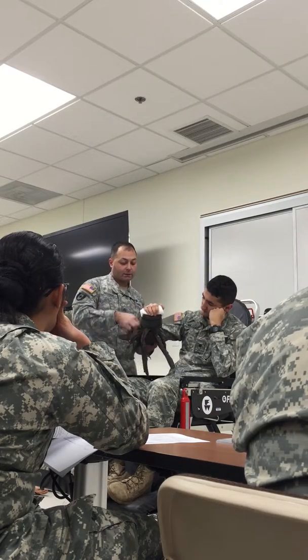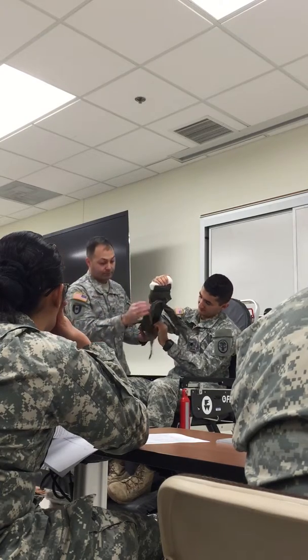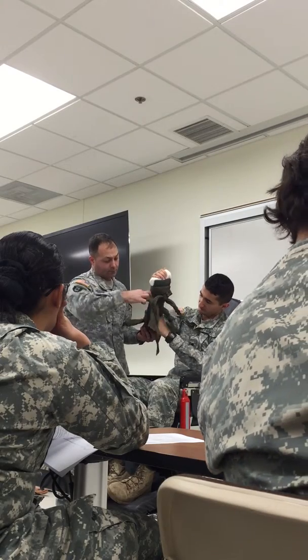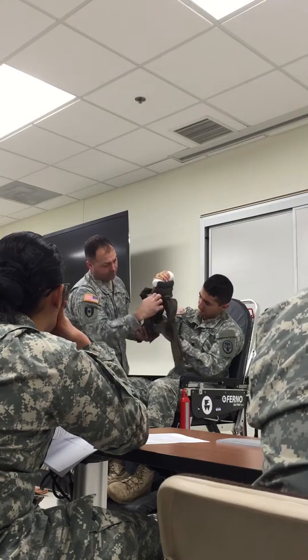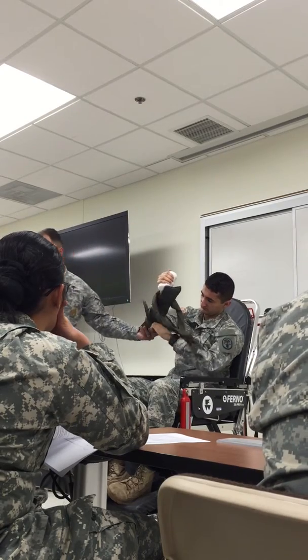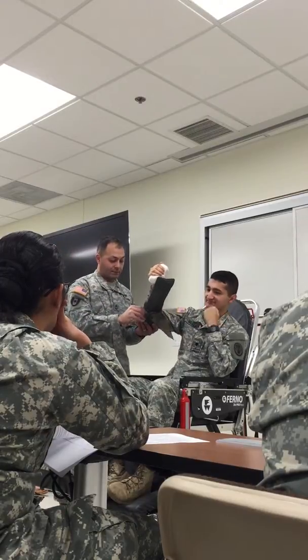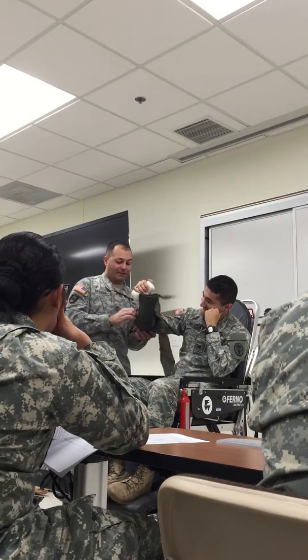Can you help me with the other? Take this off. All of them. Go ahead and pull it. Touch your injured man.